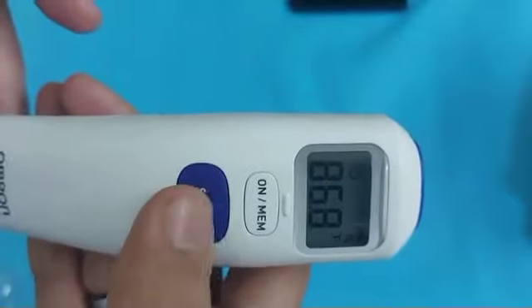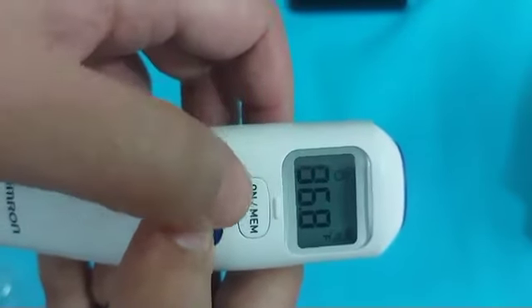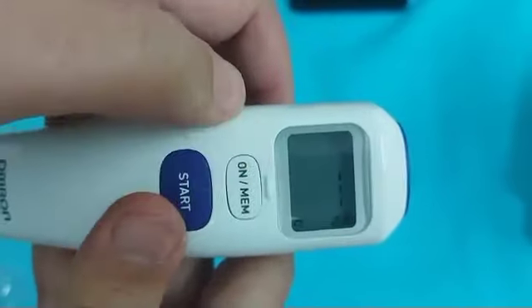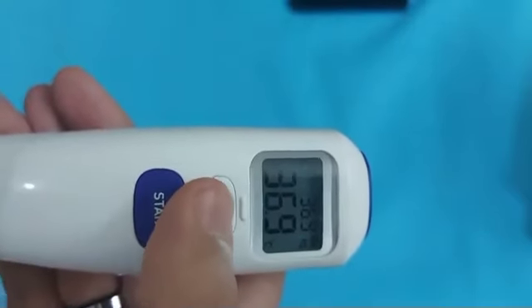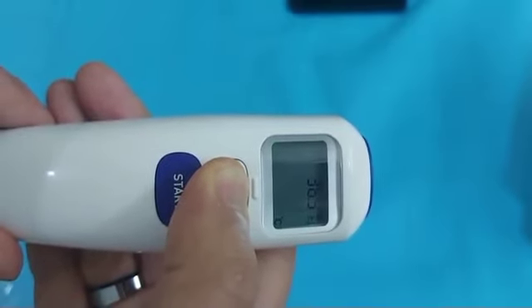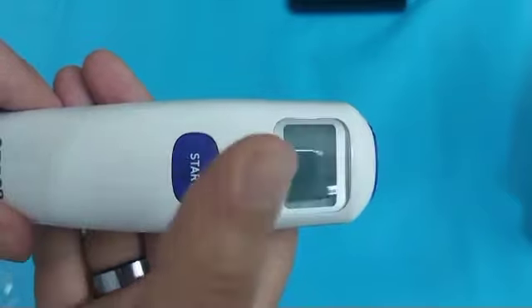To change from Fahrenheit to Celsius, turn off the thermometer or change into room temperature mode and press the Start and Memory button simultaneously. The Fahrenheit mode will be changed to Celsius and the letter C will appear on the screen. Now your thermometer will measure temperature in Celsius.